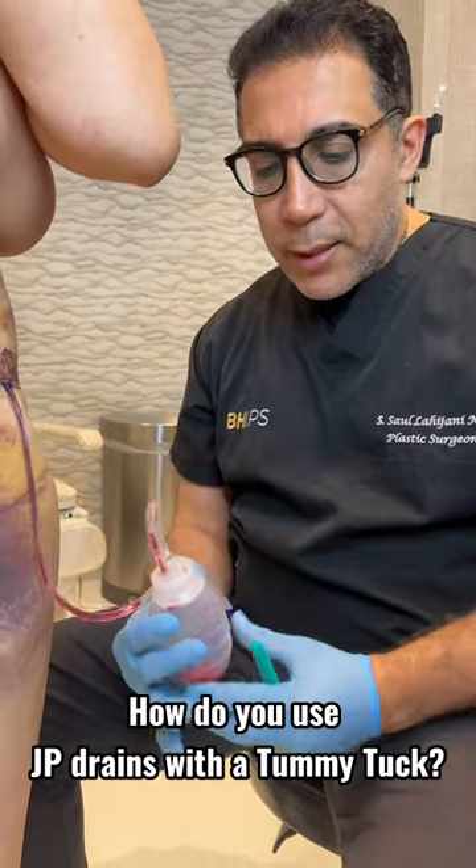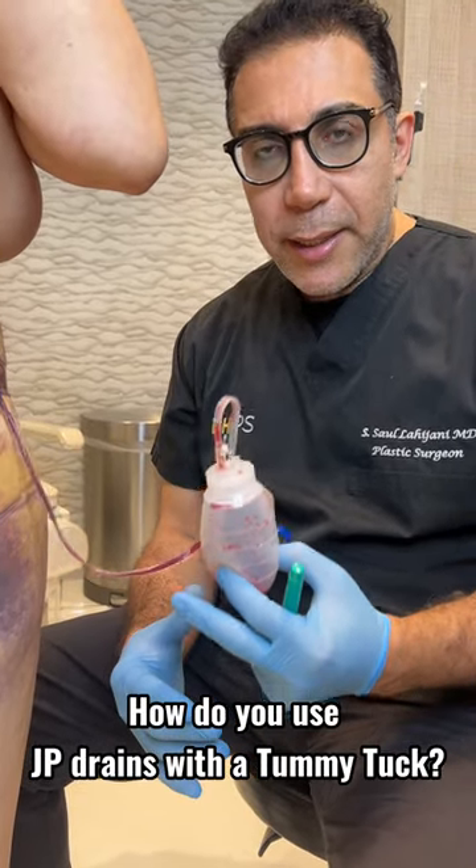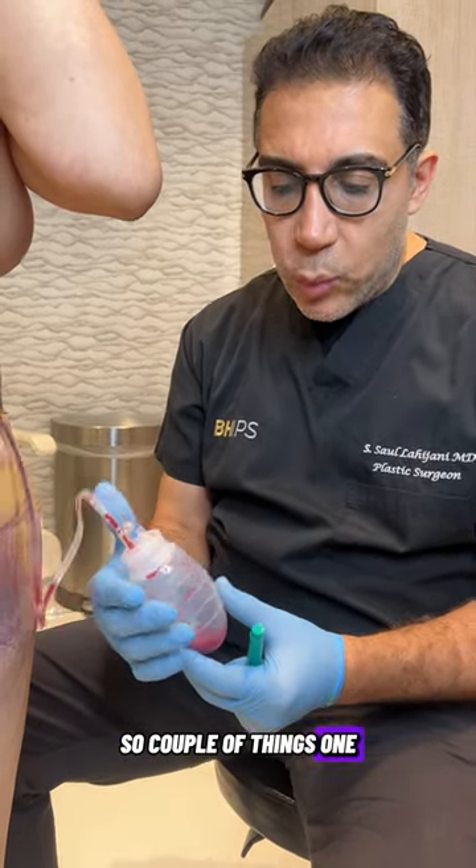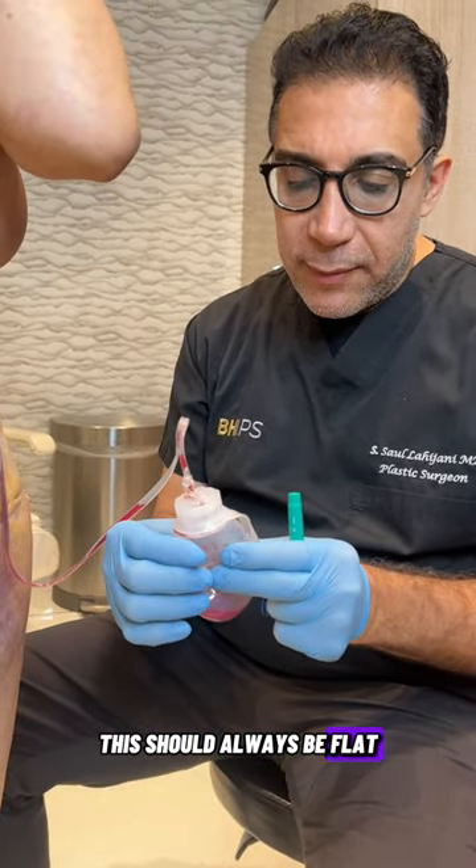Hi, Dr. Saul here. We're going to talk about the JP drains that we put in for tummy tucks. So a couple of things. One, this should always be flat.